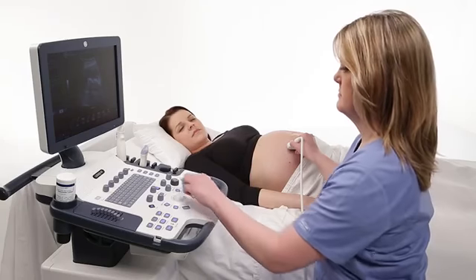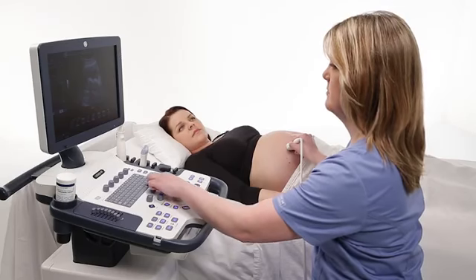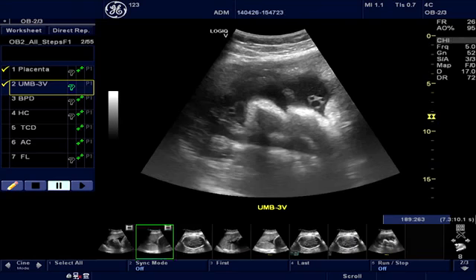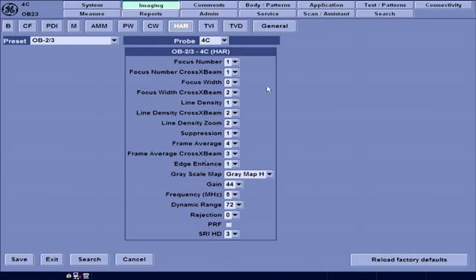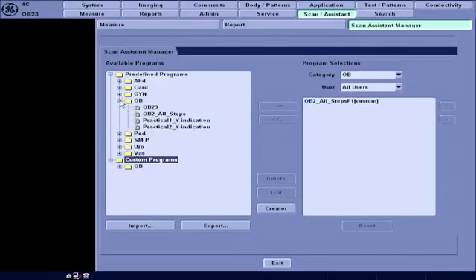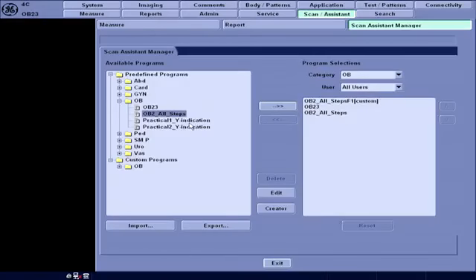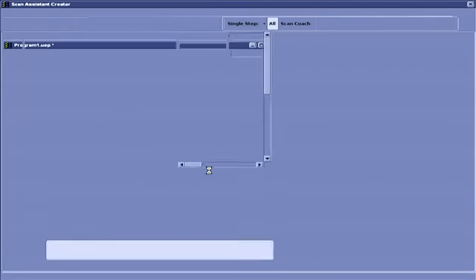Let's walk through a few steps to configure Scan Assistant for your department needs. You already have access to several protocols that come with the system, and you can customize these protocols using the Scan Assistant creator in Utility. First, let's show you where to find the protocols available on the system. Enter Utility, select Scan Assistant, and then the Scan Assistant Manager tab. The available menu on the left shows the default protocols available within the system. Users can push protocols to the right side of the screen so that they will be displayed for all users to choose from. To customize protocols, press Utility on the touch panel, then select Scan Assistant, then select Scan Assistant Manager and press Creator. This concludes the instructions for Scan Assistant for Logic Vision Series.